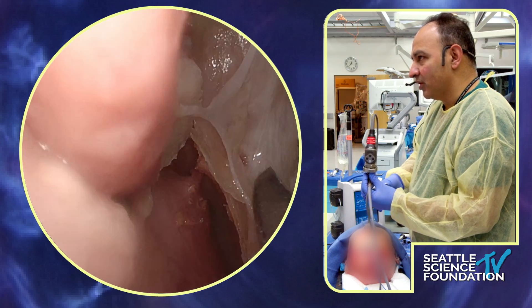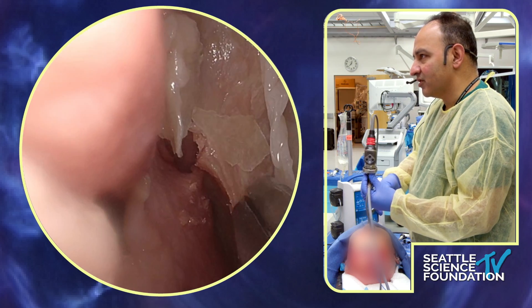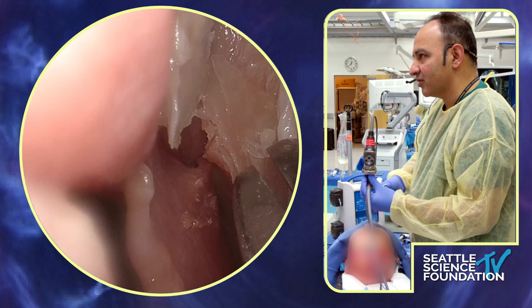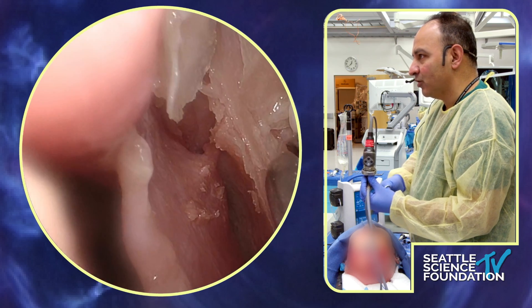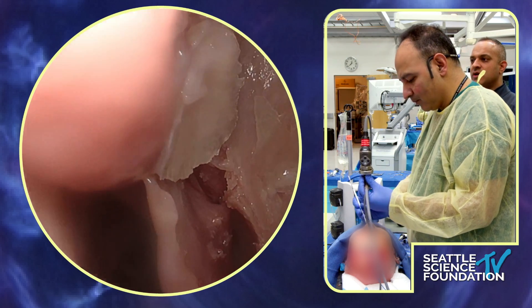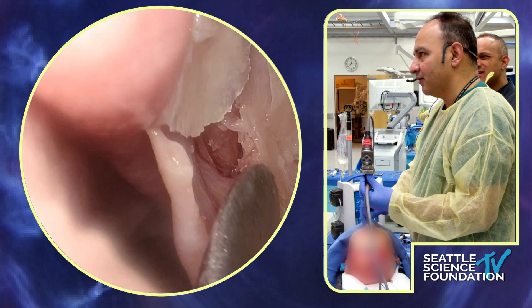This bone here is one of the buttresses — you hear about the buttresses of the sinus. This is the posterior medial aspect and the bone tends to be very hard here. This is the pterygomaxillary buttress of the maxillary sinus, and it's quite hard. In some cases I'll use a drill. Let's see if we can expose the whole pterygopalatine fossa — it just takes a while because the bone is so firm.